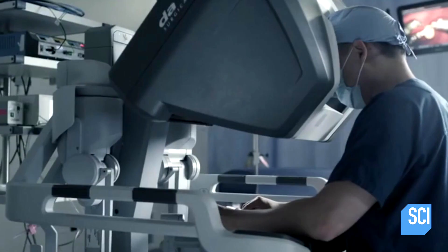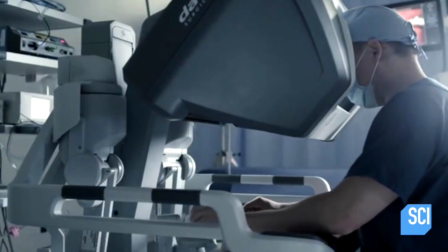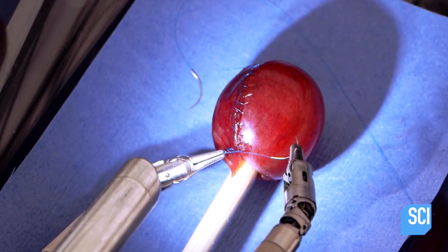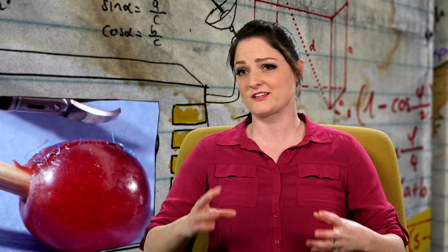Because the robot is so accurate and so steady, it does less damage to the tissue and the patient can recover faster. And today's patient? The good news is that after a quick recovery, this grape made it back to its bunch.